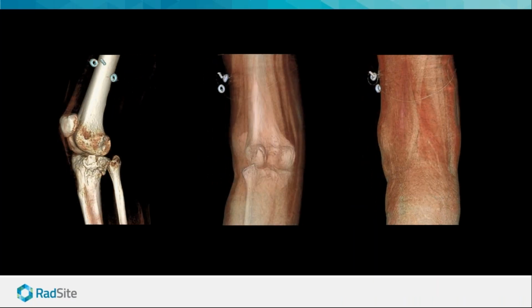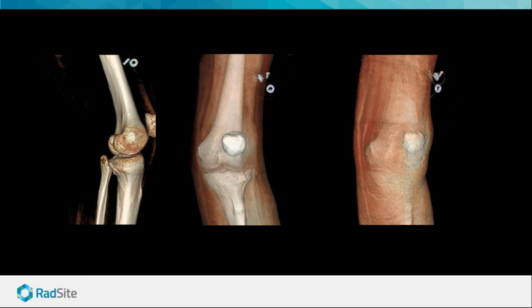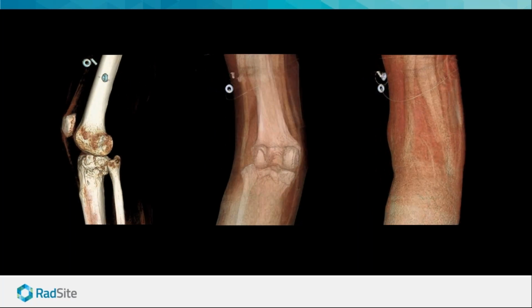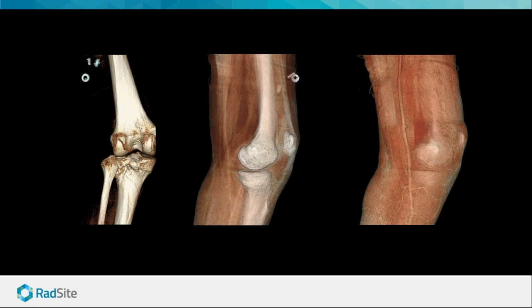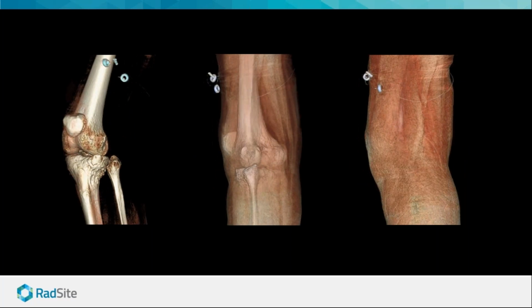And I just leave you with this nice eye candy image. So this is an attempt just to show the importance of visualization. How do you present that 3D data? This is the same data from the same patient with 3 slightly different opacities and colorizations on the data.